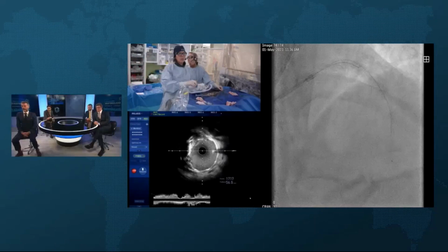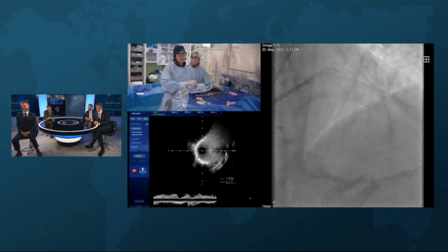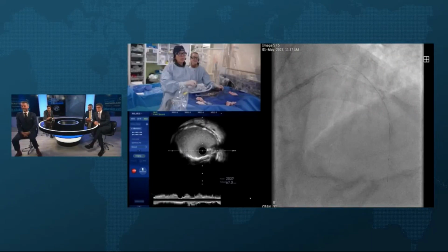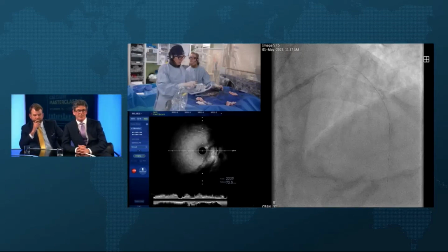How much contrast have we used? Say a small number. Just 12, isn't it? Fine. Just say 12. As it's coming across the circ, that's nice. That's perfect. We can go back over this later. Nice job, guys. There's a lot to talk about. Okay, brilliant.